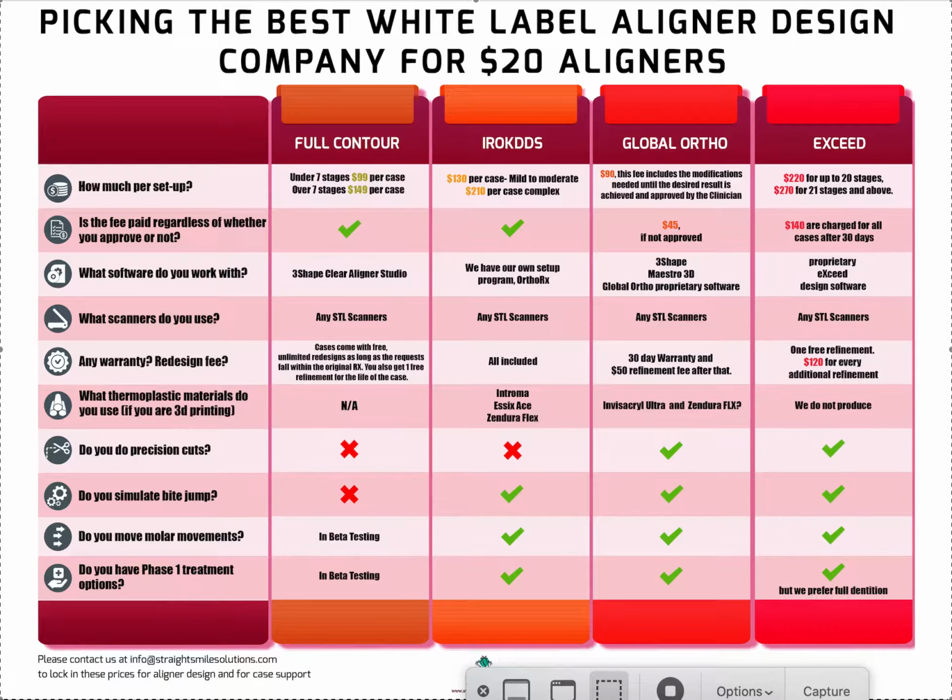Basically, in a nutshell, aligners have been around since the 1940s. They were just in a slightly different format, a more rubberized format. We called them positioners, right? There are positioners that are sold by many different orthodontic companies and labs. Nothing special about it at this point.